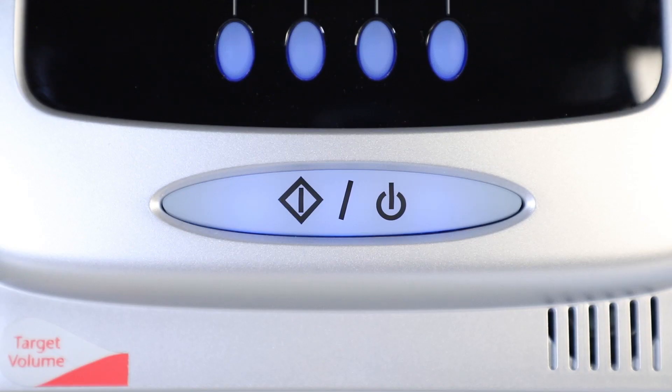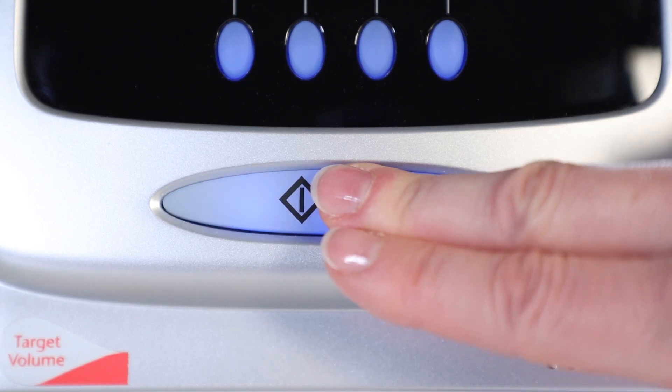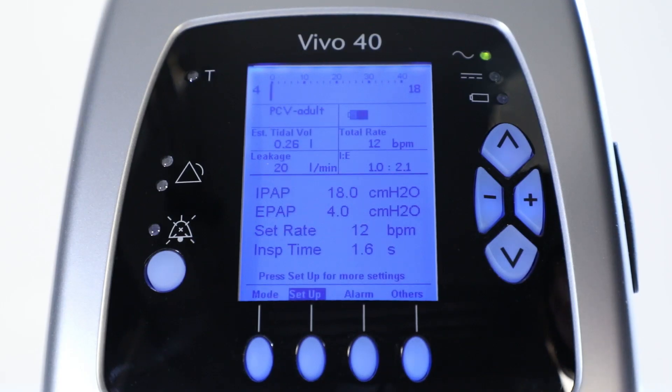Press the start stop button on the front panel for 2 seconds. A short sound signal must be heard. If not, don't use the ventilator.